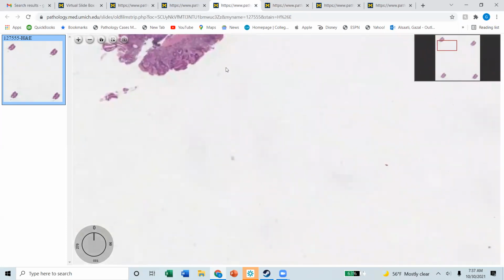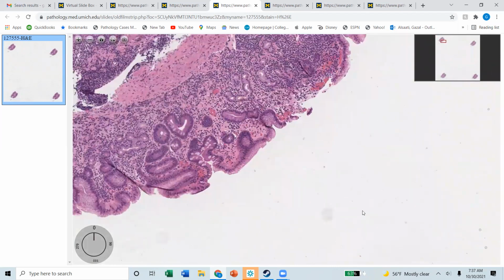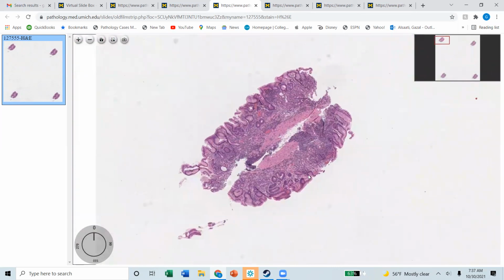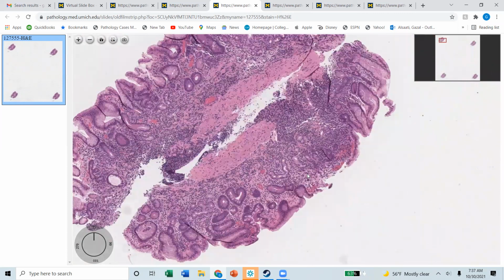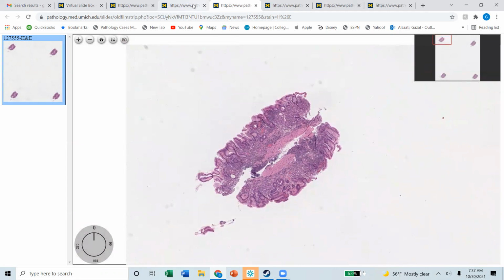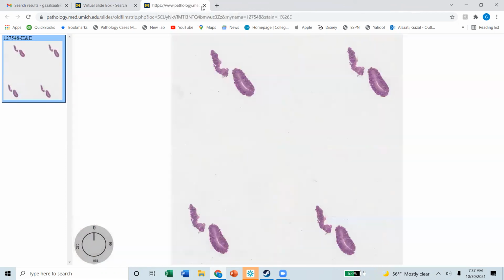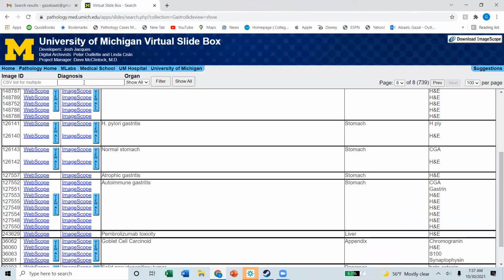No, it's very helpful. Thank you so much, Dr. Alsaati. You're very welcome. And then once you get into the habit of what to look for and how to proceed, it becomes very easy for you to make the diagnosis. Okay, moving on. I think AMAG got sufficient attention from us.